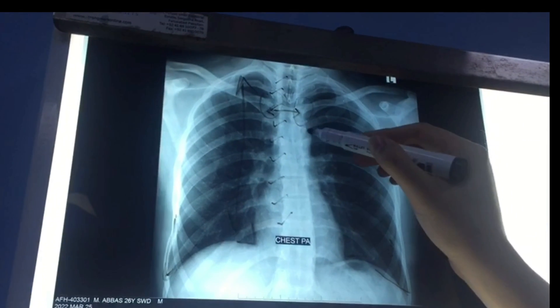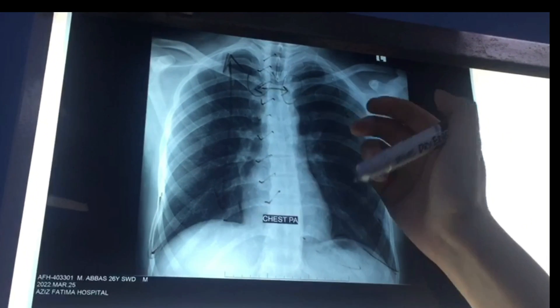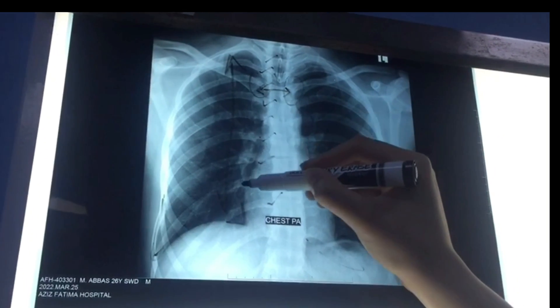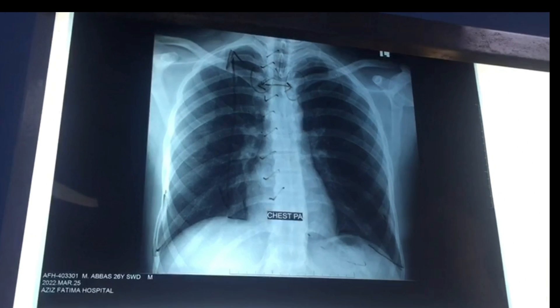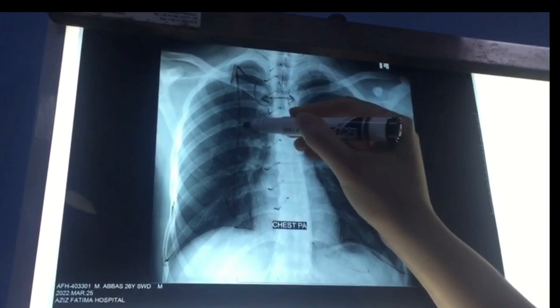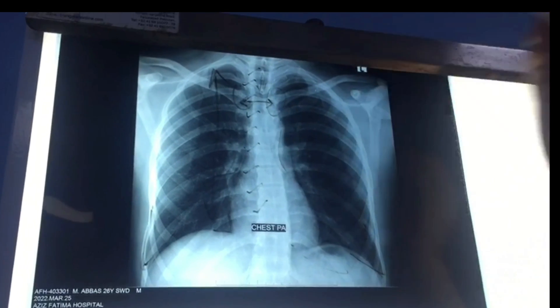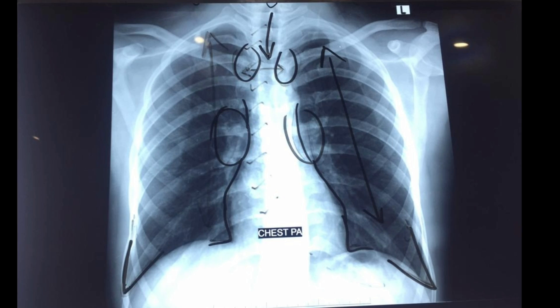The sixth step is to assess cardiac size and the borders of the heart — this is the left border and this is the right border. The seventh step is to look at the hilum. On both sides the hilum appears normal. The hilum is the structure where veins and arteries enter the lungs; it is mostly K- or C-shaped.